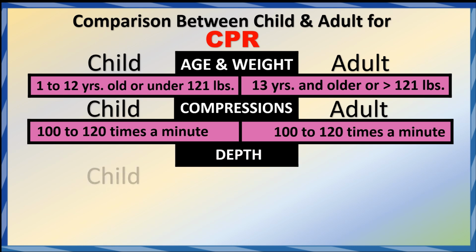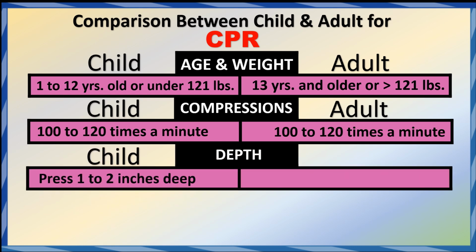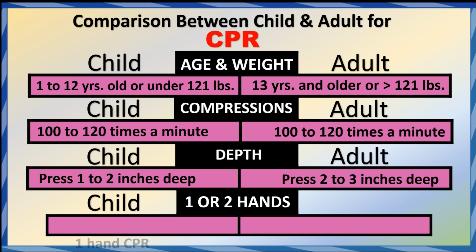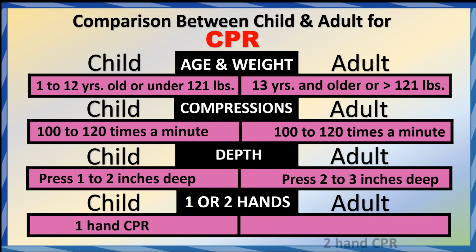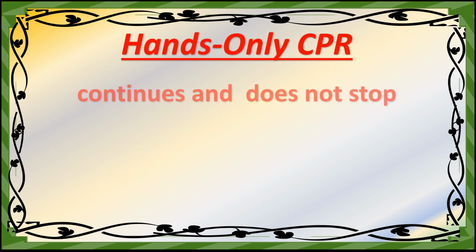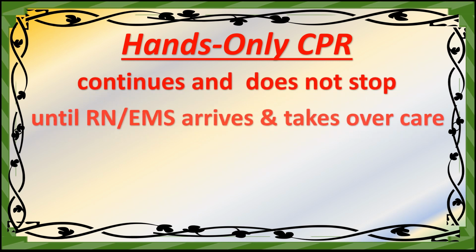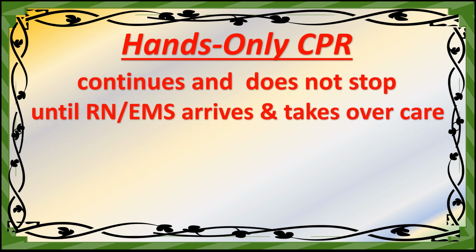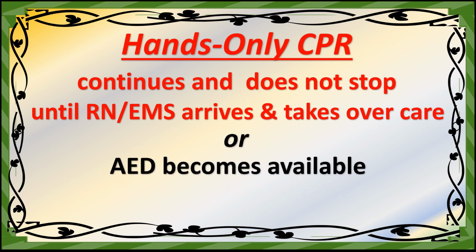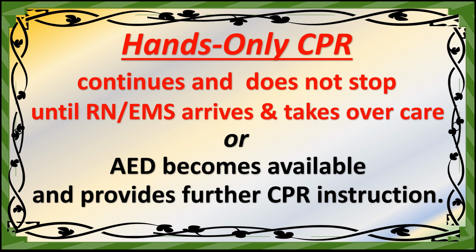Depth. For the child, press 1 to 2 inches deep. For the adult, press 2 to 3 inches deep. 1 or 2 hands. For the child, 1 hand CPR. For the adult, 2 hand CPR. Hands-only CPR continues and does not stop until EMS arrives and takes over care, or an AED becomes available and provides further CPR instruction.